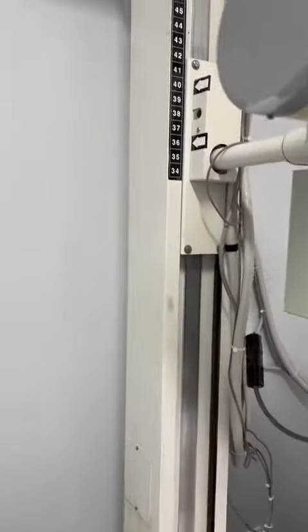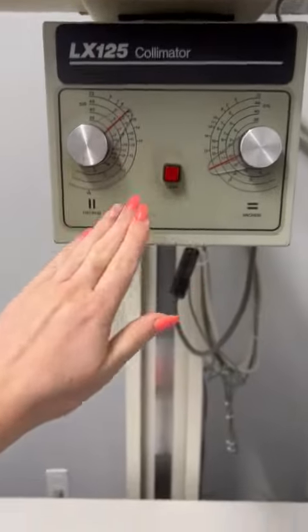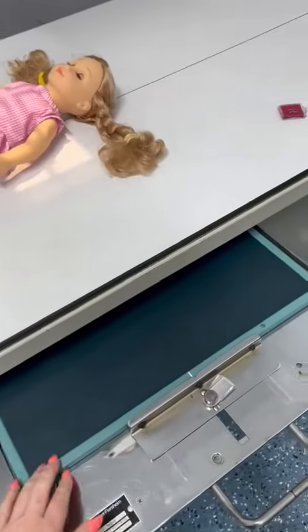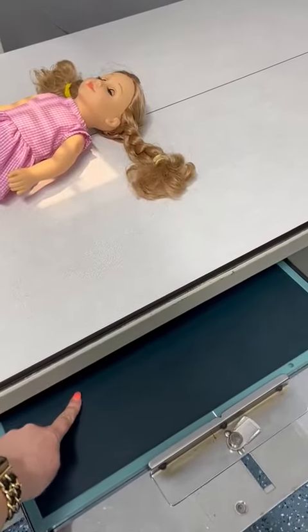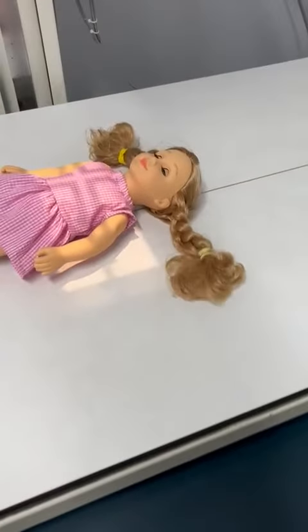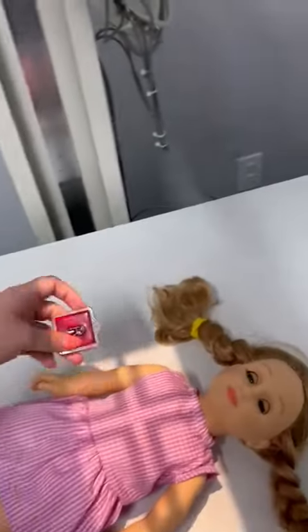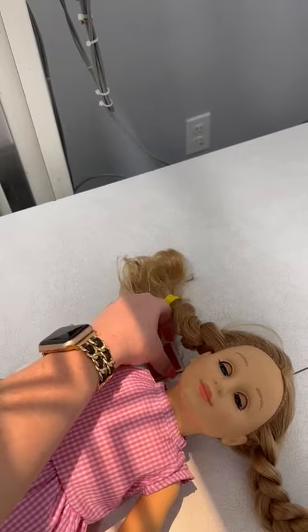So now we're going to make sure our tube is aligned and the top arrow is at 40. And turn this on. Make sure we're lined up with our board. Our board is in here lengthwise. You can put the marker somewhere in here if you'd like, but it's easiest to just put it right on the table. So I'm going to put this right next to her here. Make sure it's not in the anatomy.